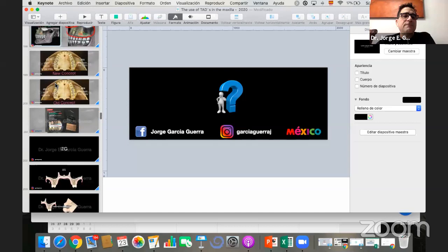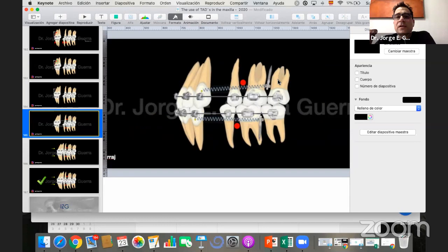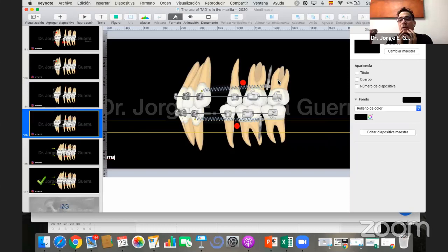And Dr. Rakesh Kaul is asking, have you used TADs in degenerative dentition, severe bone loss, periodontal breakdown cases in adults anytime? Yes. I sometimes use them to help us with the anchorage when you don't have any teeth in the dental area. I sometimes use them.